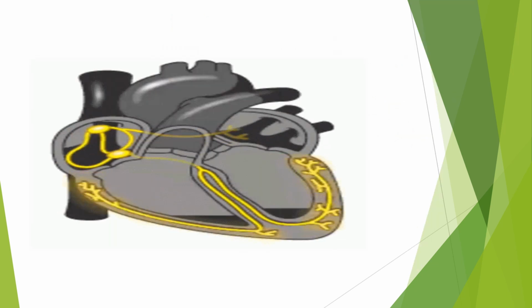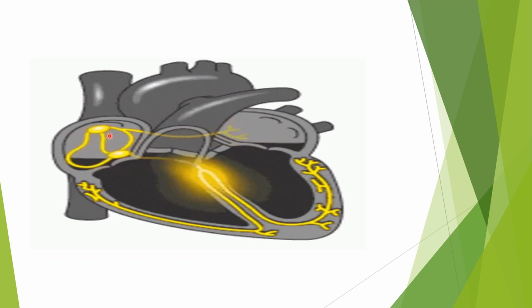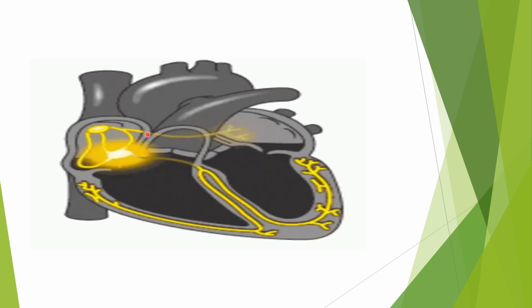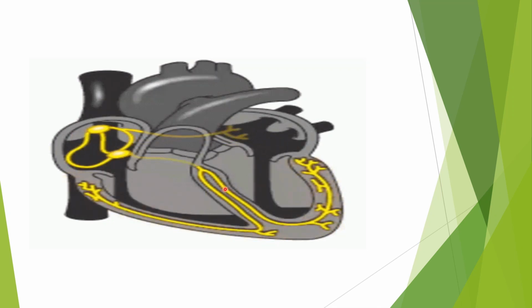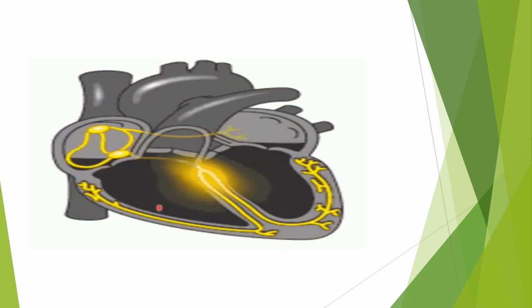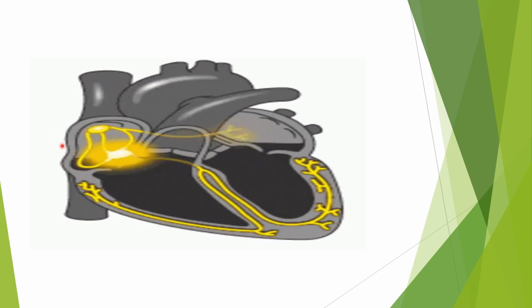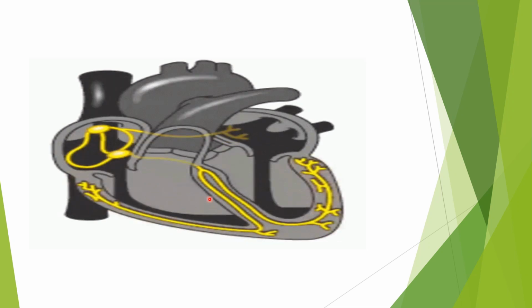This picture shows the conduction system of the heart. SA node, which is the pacemaker of the heart, produces electrical impulses and it is transmitted to both atria and the atria get contracted. Electrical impulses are also transmitted to the AV node and from the AV node to the bundle of His and then to the left and right bundle branches and then to the Purkinje fibers. Finally the ventricles get contracted. These electrical impulses are also transmitted to the entire surrounding tissue and to the skin. When we place electrodes of the ECG machine onto the skin, these electrodes will receive the impulses and they are processed to an ECG or the electrocardiogram.